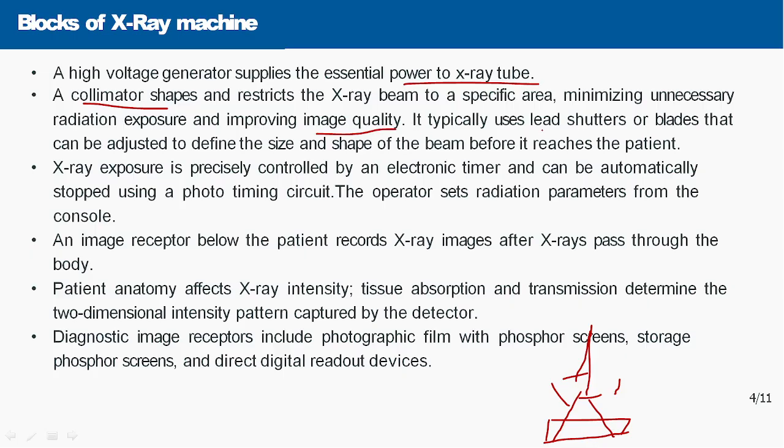It typically uses lead shutters. As I have shown here, these are the lead shutters or blades that can be adjusted to define the size and shape of the beam before it reaches the patient. So the collimator plays a crucial role in improving image quality.